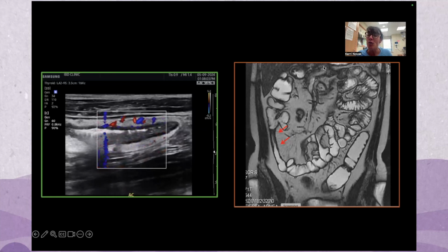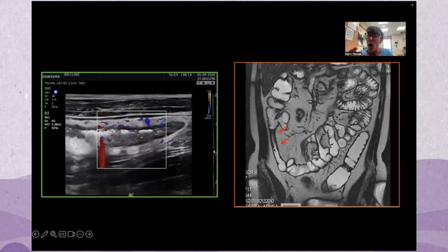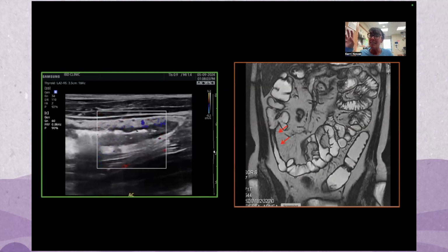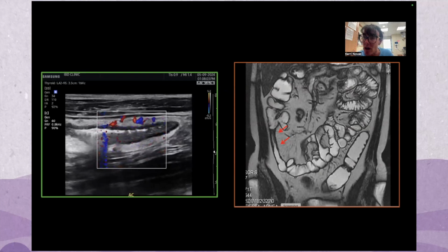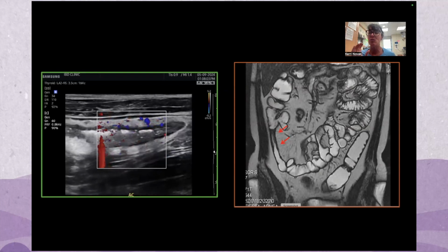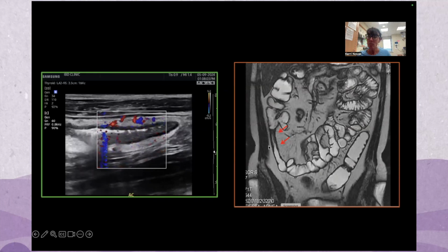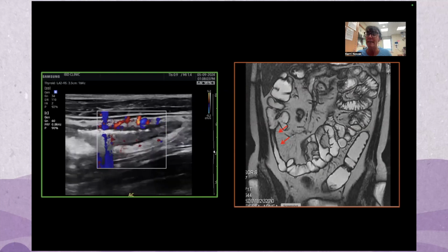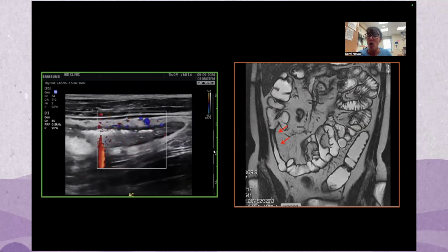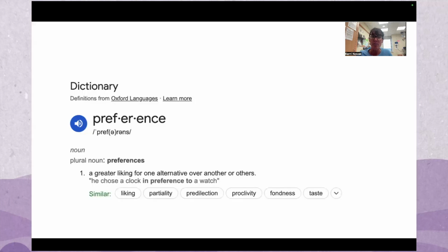And then here on the right-hand side, you've got an image of an MR image, and you've got mesenteric inflammatory fat. You have a normal colon, but a terminal ileal stricture. And you don't see any dilatation behind that narrowing. So the red arrows show thickening of the wall of the bowel. We know that ultrasound correlates extremely well with both MR and CT as measures of cross-sectional imaging.